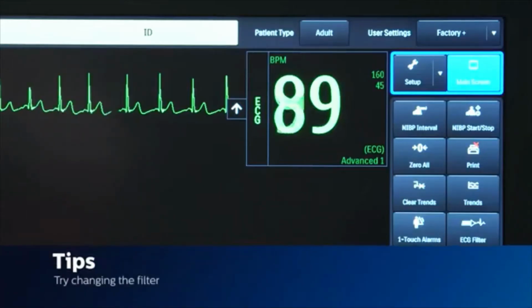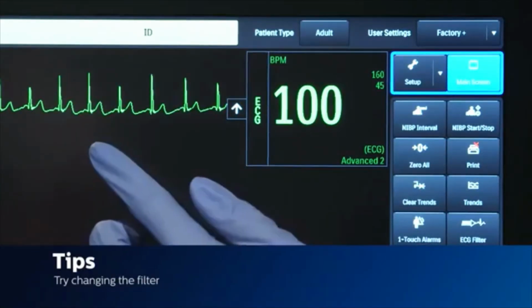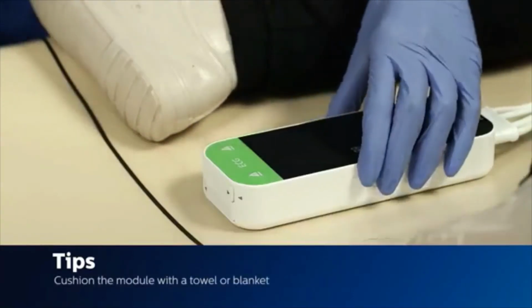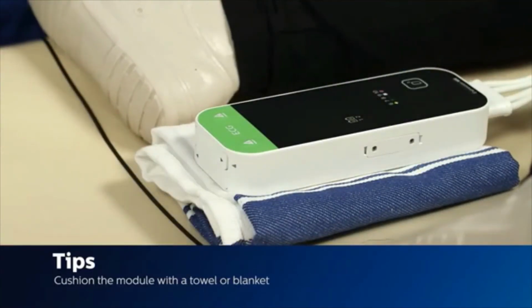Tips: if you start your scan and you begin to get artifact, go ahead and try to change the filter. These filters were made to weed out different noises from the MR. Place the module on a cushioned surface such as a blanket or towel to minimize MR vibrations.